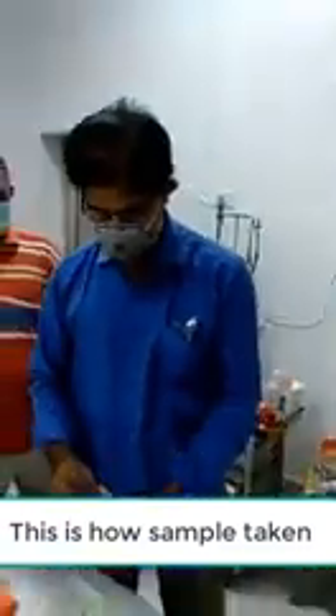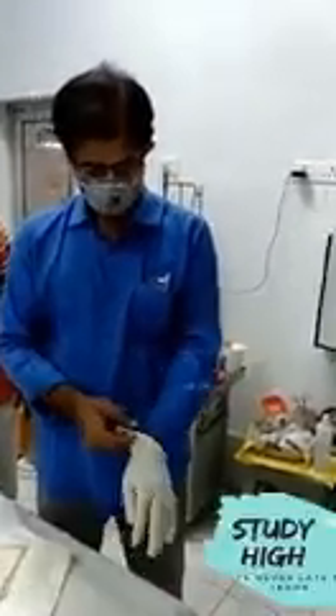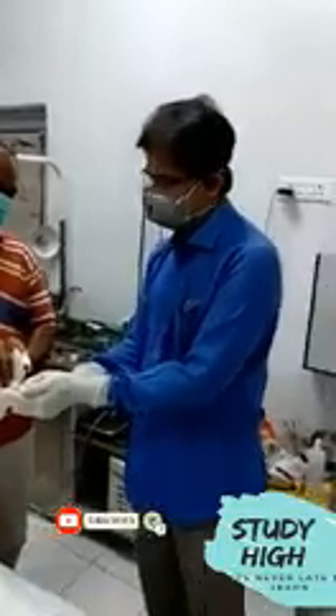This is the second case for which the sampling will be taken by Dr. Ravikant again. It is getting ready and is almost ready. Sanitizing the hands with sanitizer. The patient is also ready. It has been sprayed another time.